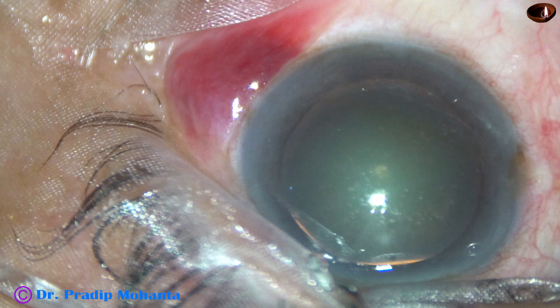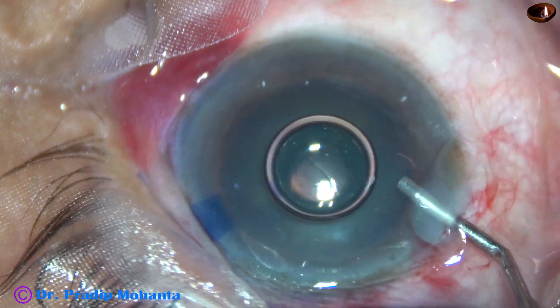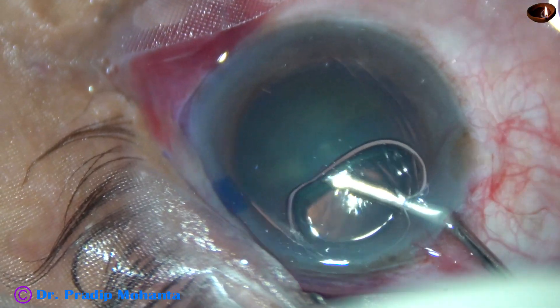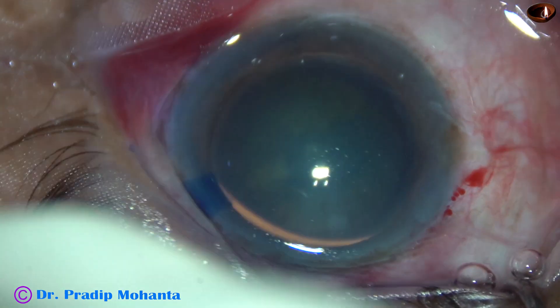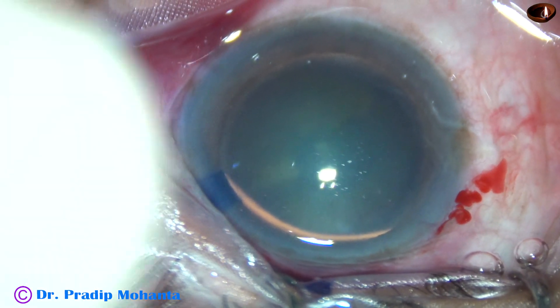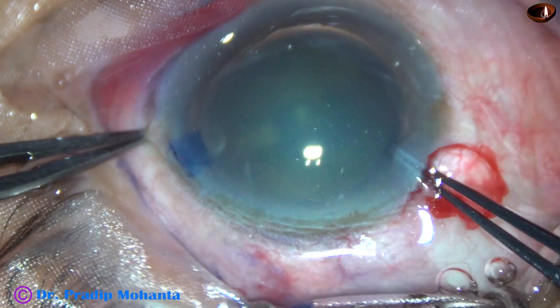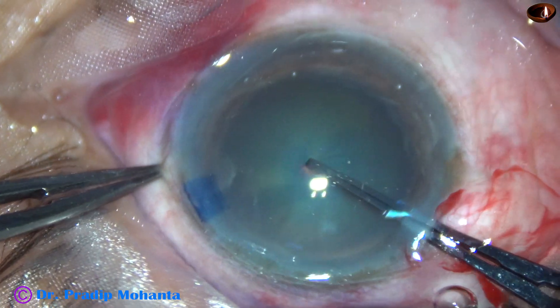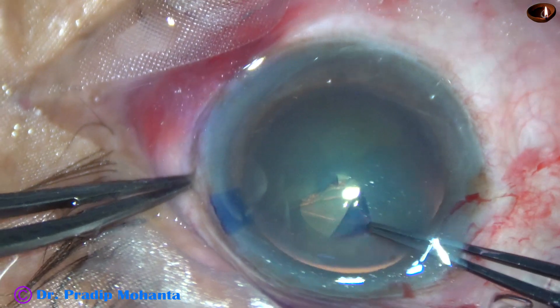This is a cataract with grade 3 nuclear sclerosis. In this case, I have done emulsification of the nuclear pieces, cortical cleanup, and polishing of the posterior capsule by the FACO handpiece itself. I have also done bevel-down submarine chop in this case. Let us observe the surgery after incisions and staining the capsule with trypan blue dye.